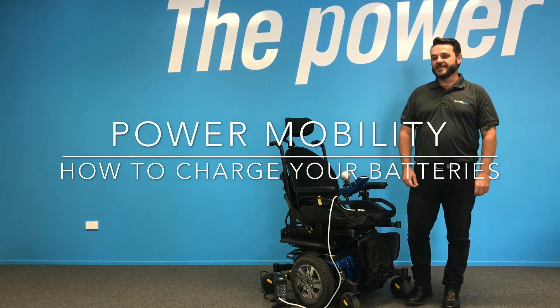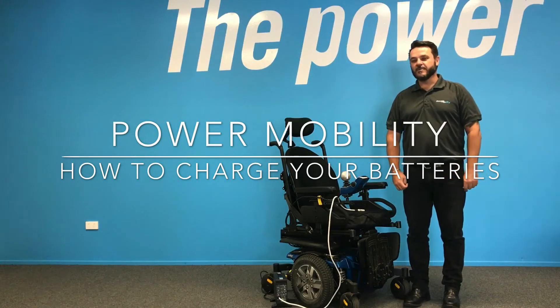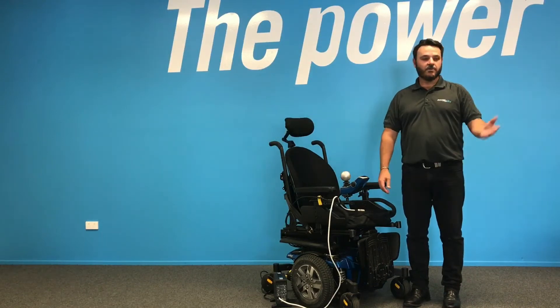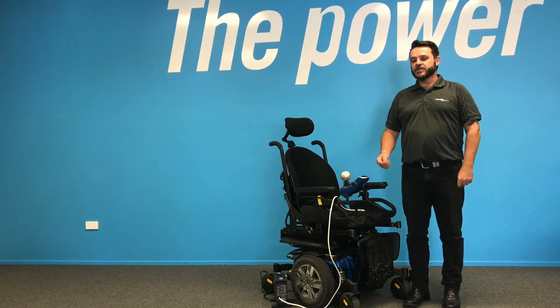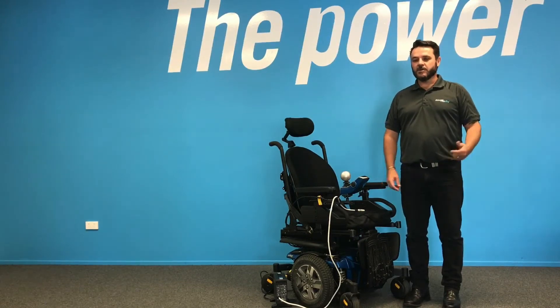Hi, I'm Nigel from Power Mobility. Today we're going to run through charging batteries, whether it be for a new power chair or a new scooter. Always remember that new batteries must be fully charged before you actually use the power chair or scooter.